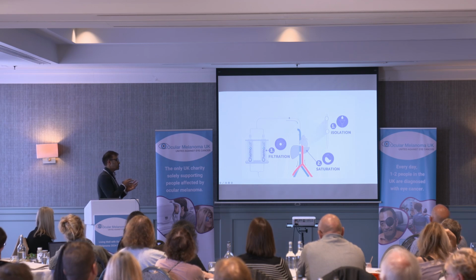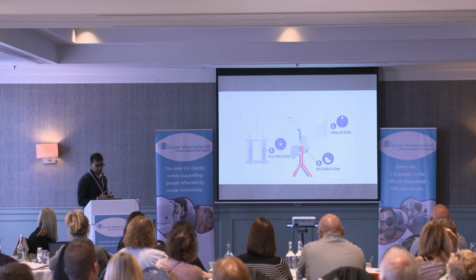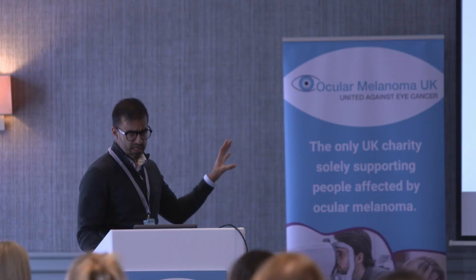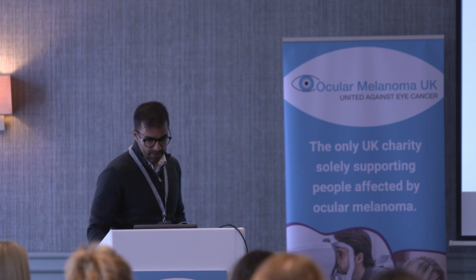The reason we do that is because we can get rid of all of that chemotherapy, which is potentially going to spread around the body, and return the blood back to the body. It means we can give really, really high dose chemotherapy to the liver in a couple of sittings, which gives the best chance of getting a good response. Does that make sense? I'm going to go through the videos as well, which makes even more sense.